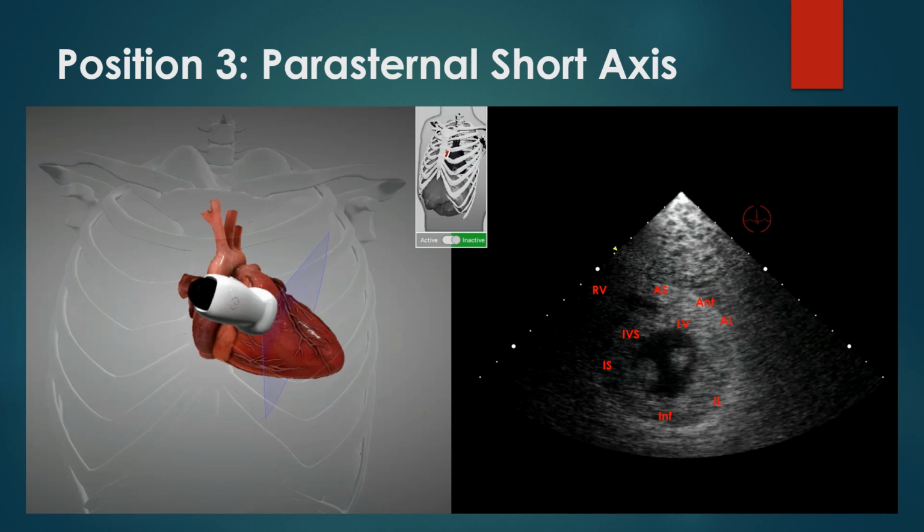If you've got the mitral valve, which looks like a fish mouth, you know you need to angle a little bit more caudally, or towards the foot. And then there's a nice view of the RV as well. I've got one clip of an Eisenmenger patient that, of course, you don't keep these things, but the RV took up just about the entire screen, and the LV was just a little smidge because the RV was so huge and such a dominant chamber.